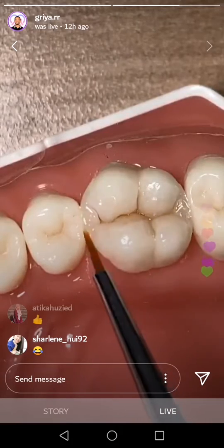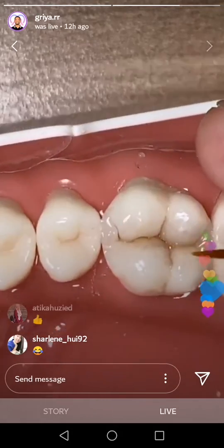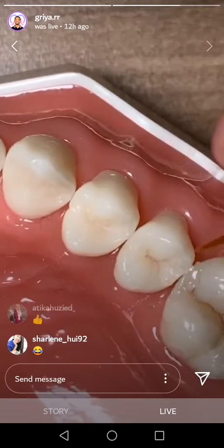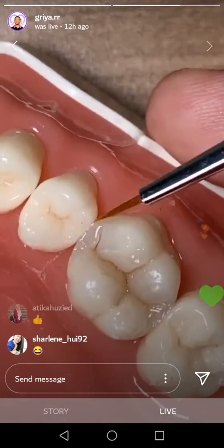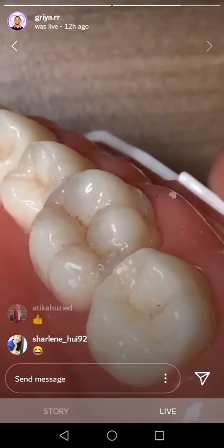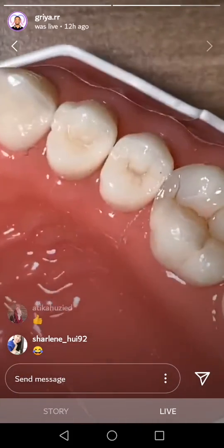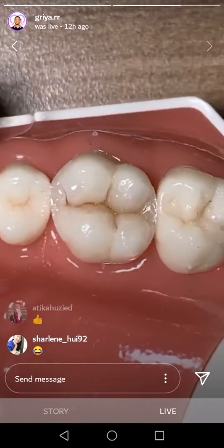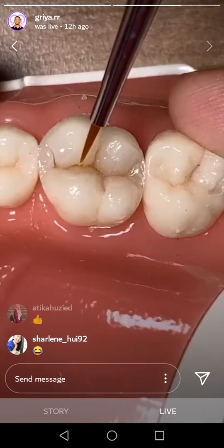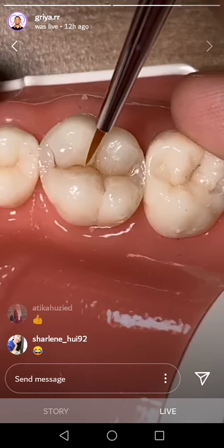Actually, I don't like to use my stain. I put on the last layer because, you know, last layer I think it's a little bit dirty. I mean, you put stain after all done. I don't think that's a good idea because it looks very dirty. If you don't have a sharp instrument, I don't recommend you to do that. So I always put stain color inside the dentin.